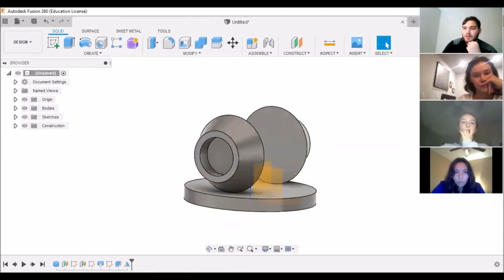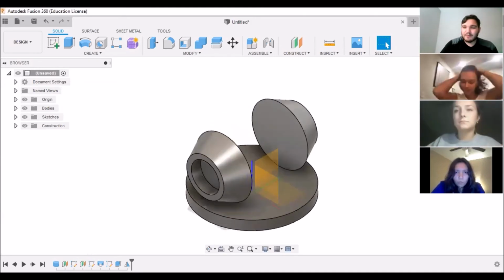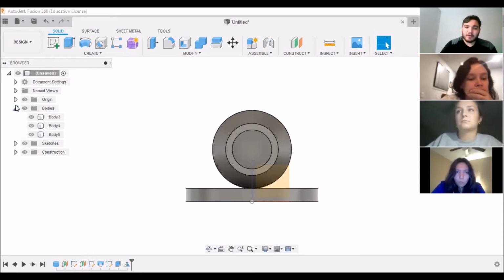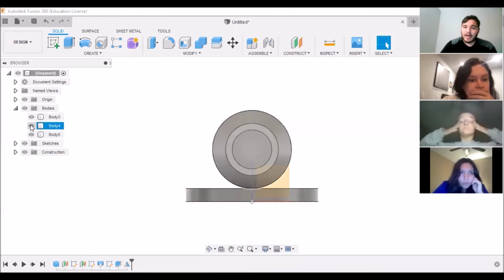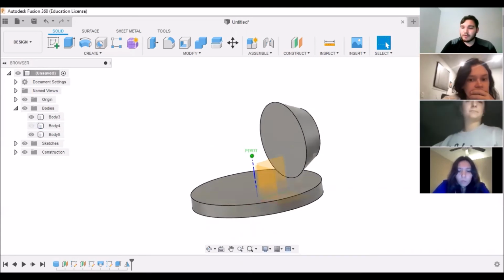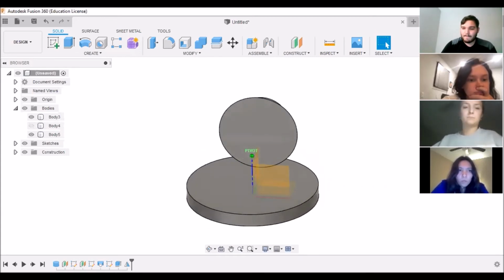Cool. And at any point, so let's say we're going to now try to connect them to the base, but it doesn't really work whenever I do a frontal view because now I can't see the back edge of the cap. If you go to the drop down on bodies, you can see that the mirror images are different bodies of one another, and the little eye button you can actually click and it turns it off. So you can see through the geometries. Okay.